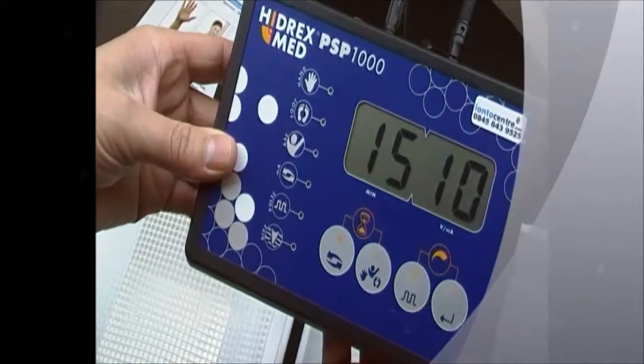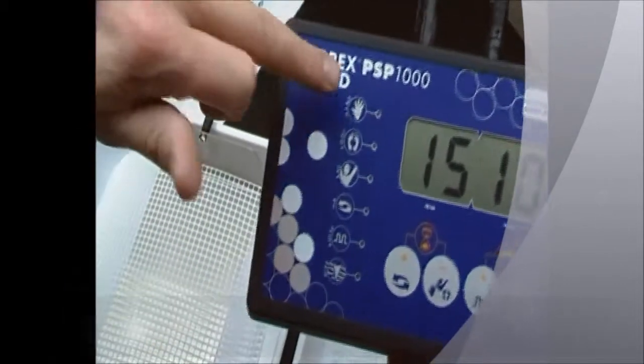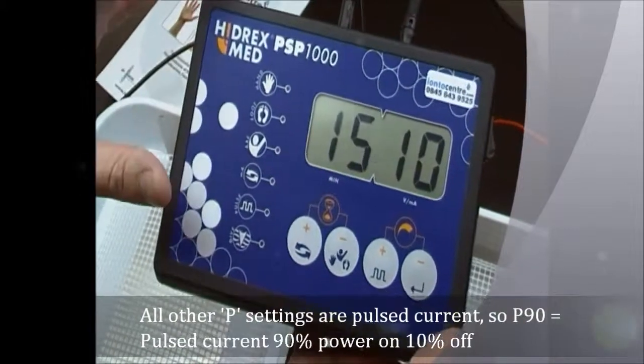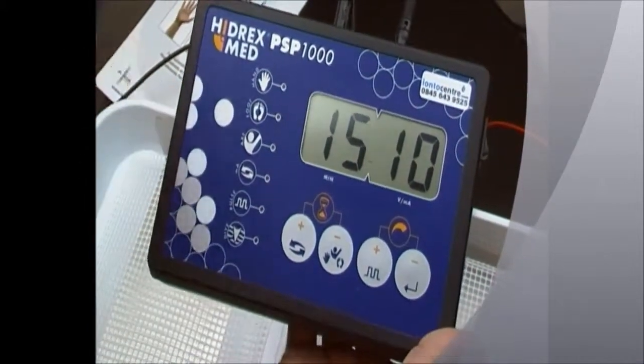When you're happy with your selection, just click enter. You'll see down here all six LEDs are off.